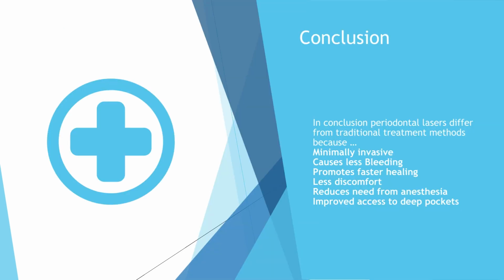In conclusion, periodontal laser differs from traditional treatment methods because it is minimally invasive, causes less bleeding, and promotes faster healing and less discomfort. It reduces the need for anesthesia, improves access to deeper pockets.